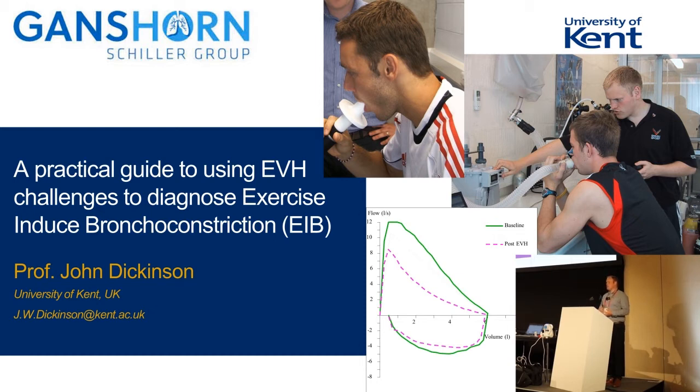What I'm hoping to do today is to talk a little bit about the assessment and how it might fit within the assessment of an athlete who might be reporting respiratory symptoms. We're going to demo it, so we've got Ganshorn's equipment here, and we're going to talk about how we might use spirometry before and after it, but also how we might use a new technology like oscillometry that might be the future of pre and post testing as we go forwards.